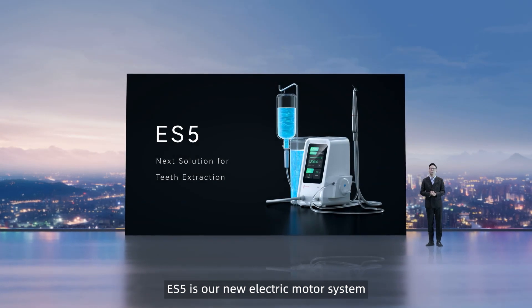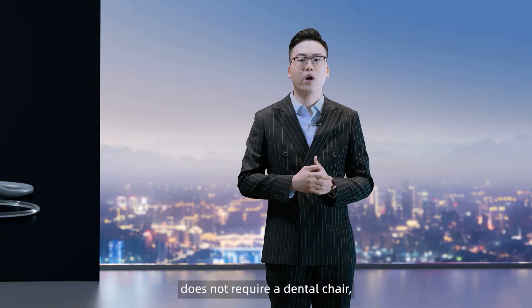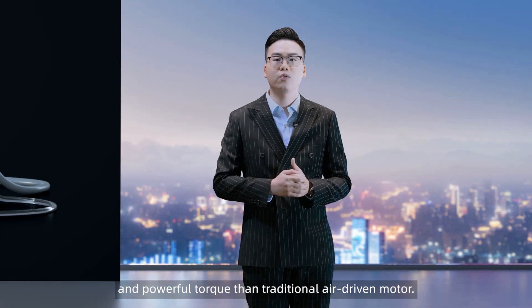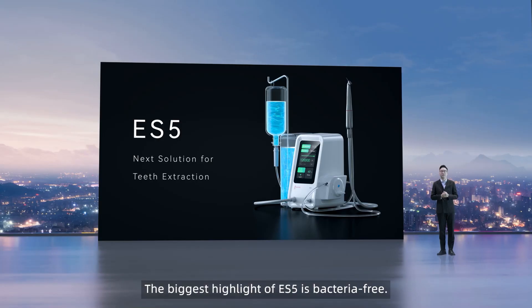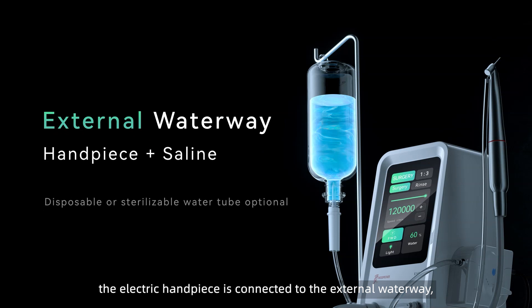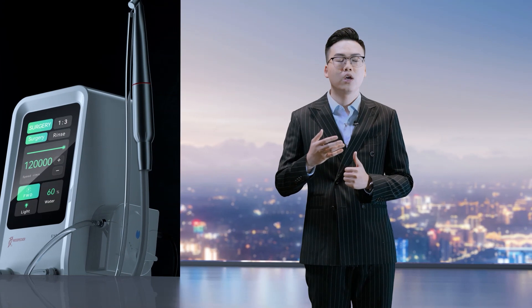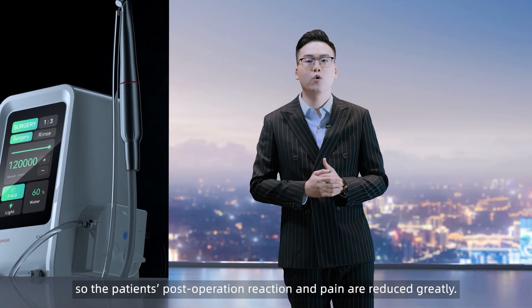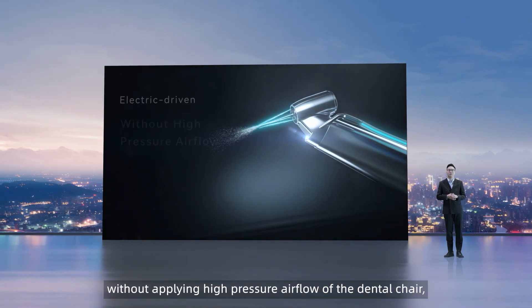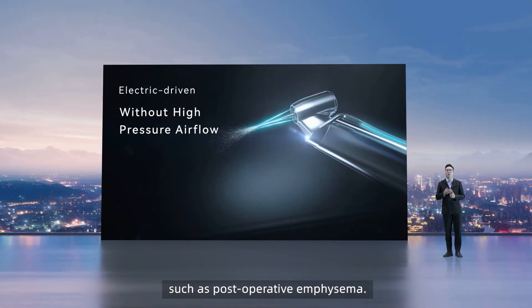ES5 is our new electric motor system that combines restorative and surgical functions. It is completely electrically powered and does not require a dental chair. It has a small size with more stable speed and powerful torque than a traditional air-driven motor. The biggest highlight of ES5 is bacteria-free. Under its surgical mode, the electric handpiece is connected to an external waterway, which can be directly supplied by sterilized and cooled saline. The irrigation tube can be optionally disposable or sterilized, so the patient's post-operation reaction and pain are greatly reduced. The electric-driven handpiece of ES5, without applying any pressure airflow from the dental chair, reduces the probability of complications such as post-operation emphysema.